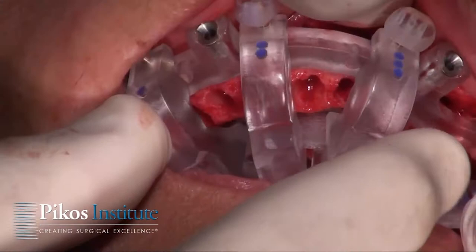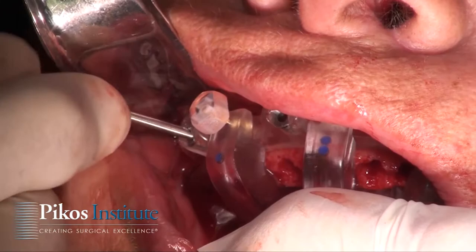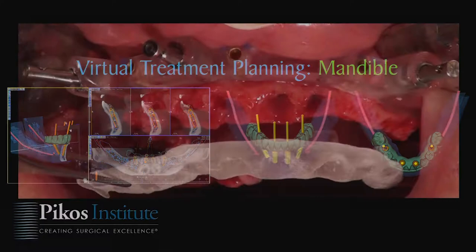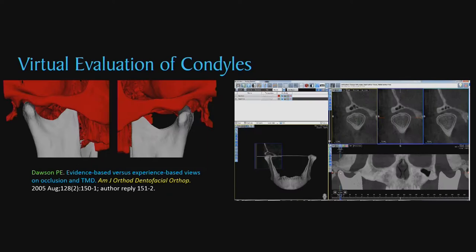We're placing what's termed a bone foundation guide, which is part of our protocol. This is indexed into the opposing arch. We then drill appropriate holes for pin fixation and remove the struts from the foundation guide. We're verifying proof of concept — comparing the lab component to the surgical reality. You can appreciate the bone reduction that is planned in advance and executed at time of surgery, which saves significant time versus our conversion protocol.